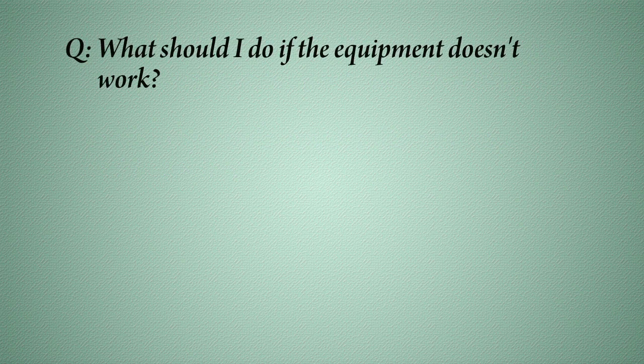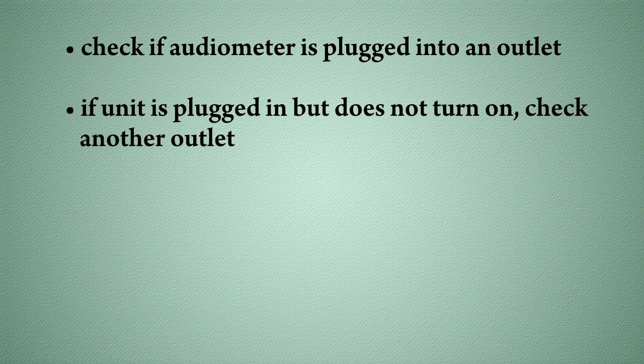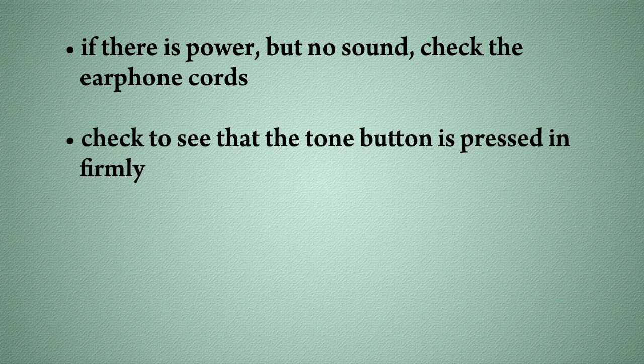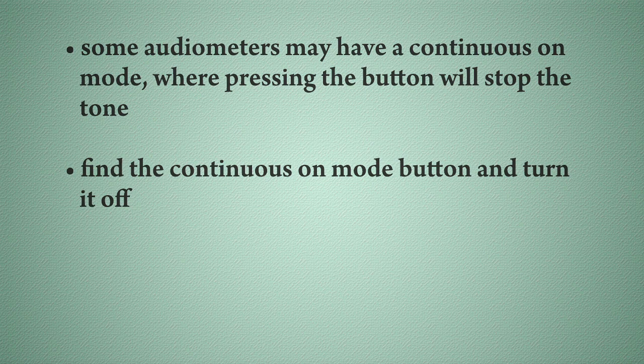What should I do if the equipment doesn't work? Check to make sure the audiometer is plugged into an outlet. If the unit is plugged in but it does not turn on, check another outlet to see if the outlet is the problem. If the outlet is fine but the unit does not turn on, make sure the power cord is not frayed and is snugly inserted into the unit. If power is getting to the audiometer but there is no sound coming out of the earphones, check to make sure the earphone cords are snugly connected to the audiometer on one end and firmly connected to the earphones on the other end. If the cords are fine, check to see that the tone button is pressed in firmly. In some cases, the audiometer will have a continuous on mode, and pressing the tone button will actually stop the tone. If this is the case, find the continuous on mode button and turn it off.